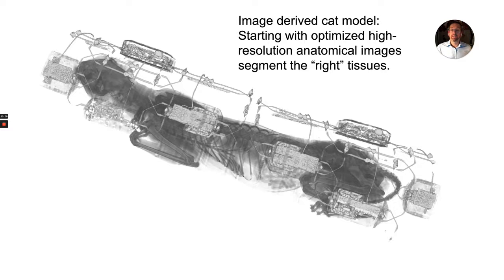And so there's a lot of piloting that's done, looking at different imaging sequences, looking at constraints, such as the condition the animal can be in during the scan, depending on how long the scan is. For example, for a smaller animal, we may be able to use a small bore CT. With a larger animal, we may not be able to use it, or we may need to do multiple scans. We're slowly moving the animal through that bore and afterwards process these images together.